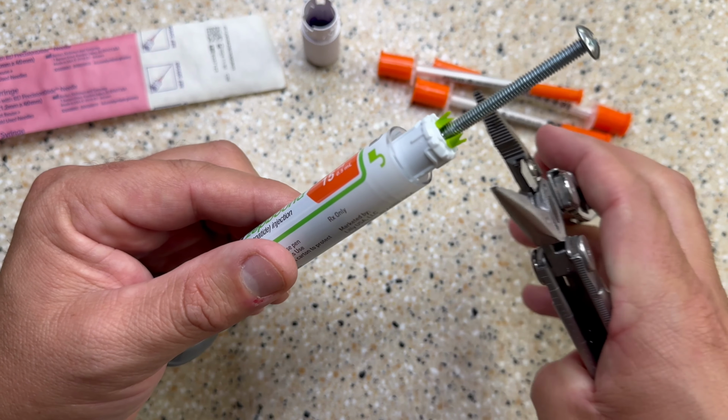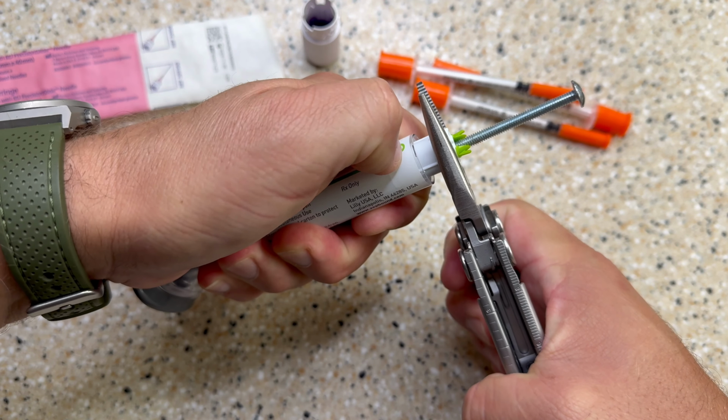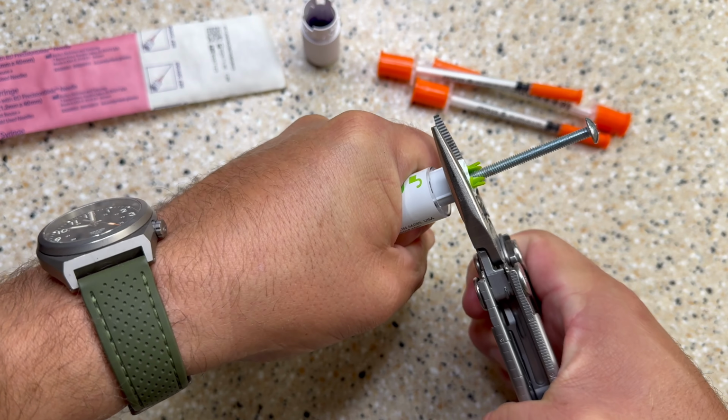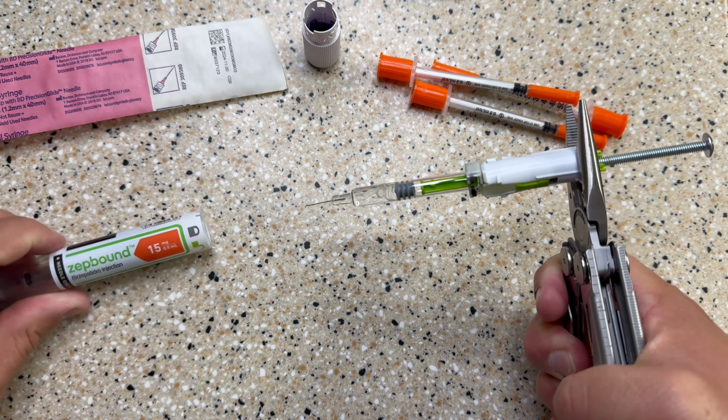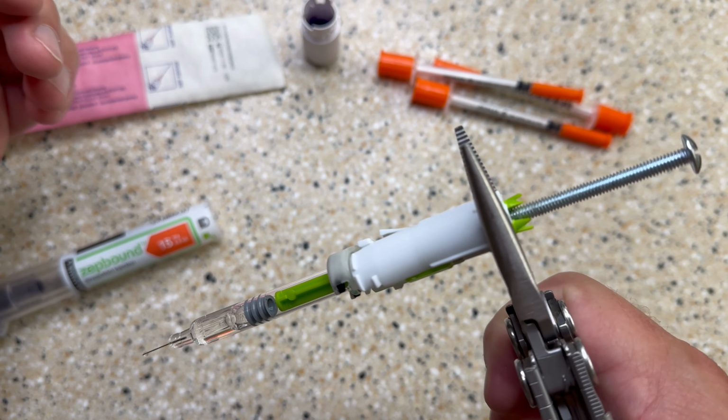We're going to clamp on with the pliers and we're going to rotate away from the lock, pull out at the same time. All right, you can see how it all came out here. It did not fire.